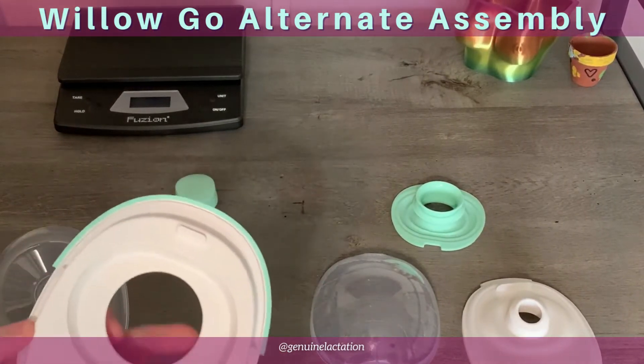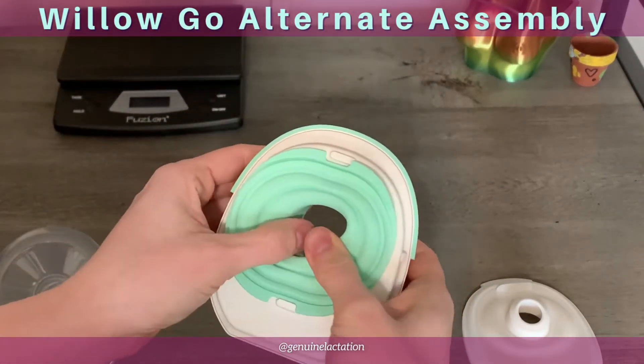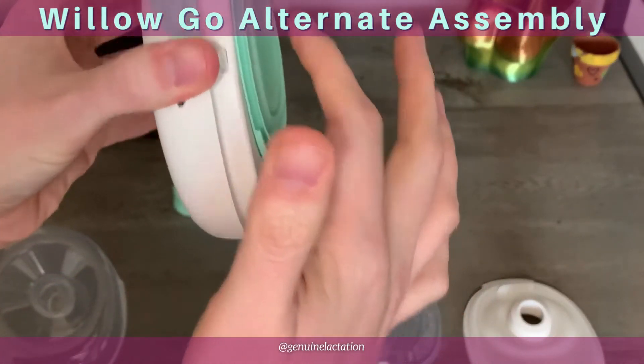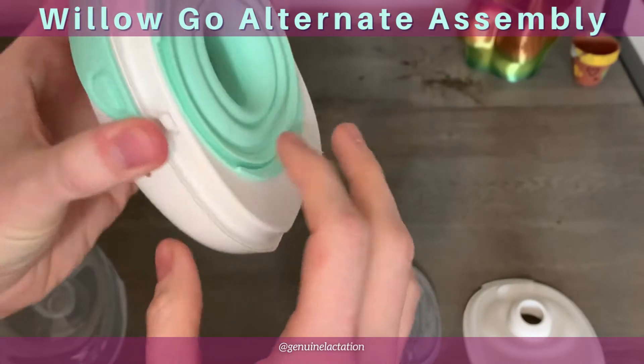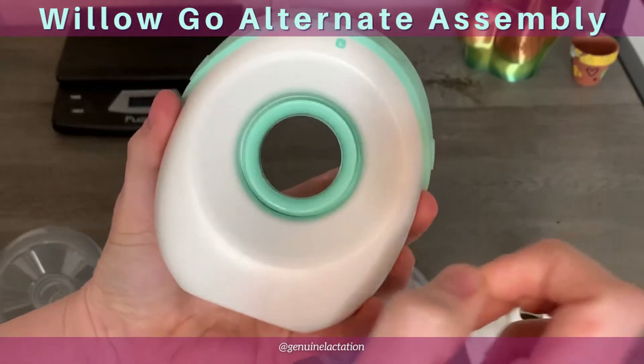You're going to take your hub and place your diaphragm on it, making sure that it popped through. Check and make sure that it is flat all the way around, and that it's all the way through and centered.